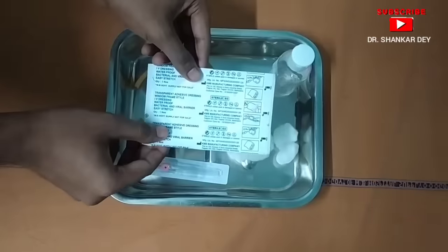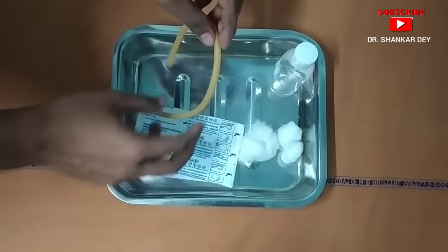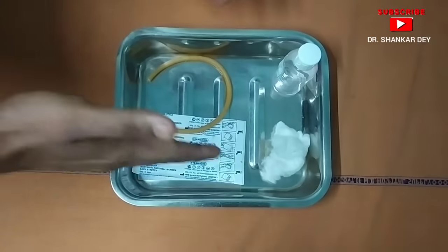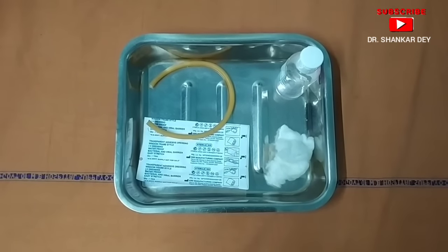Here is one adhesive tape for fixation of the IV cannula. Here is one tourniquet, and here is some cotton with alcohol or spirit. With these things I am going to show you the procedure of IV cannula insertion.